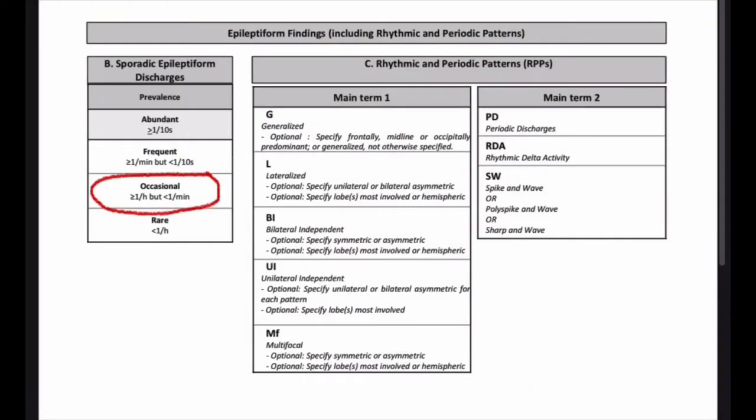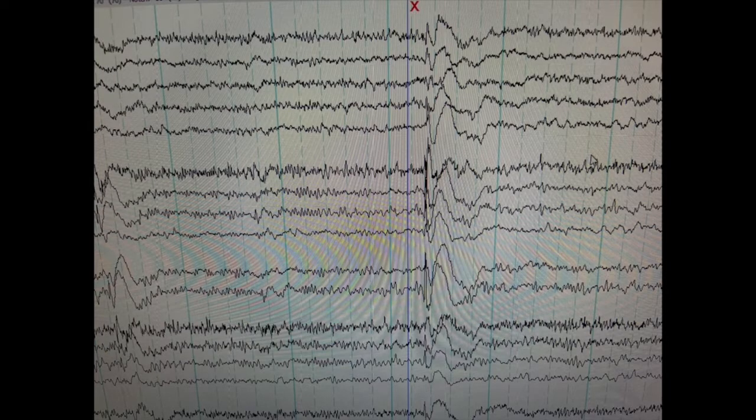The epileptic discharges didn't go on runs — it was just single spike-and-wave, single spike-and-wave, and they didn't happen too often. In the ACNS guidelines you can describe how often they occur; in this case I described them as occasional left paracentral dominant spike-wave discharges. They happened on the left side of the brain only occasionally — I marked maybe five throughout the EEG, all singular with no runs and no evolution over time.